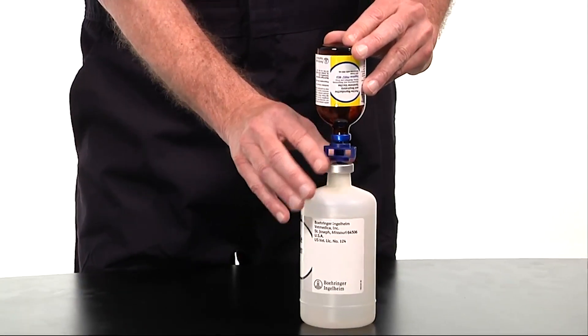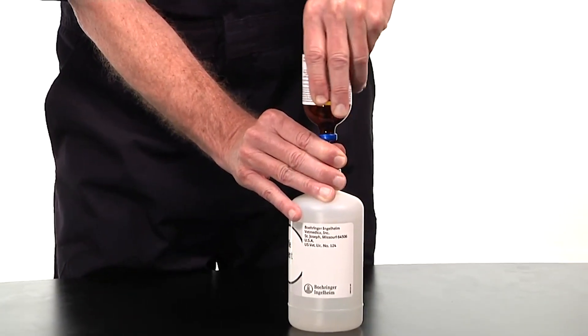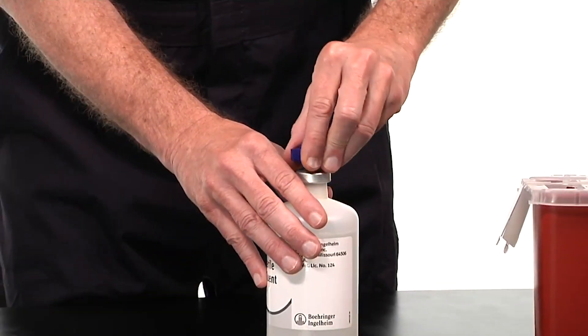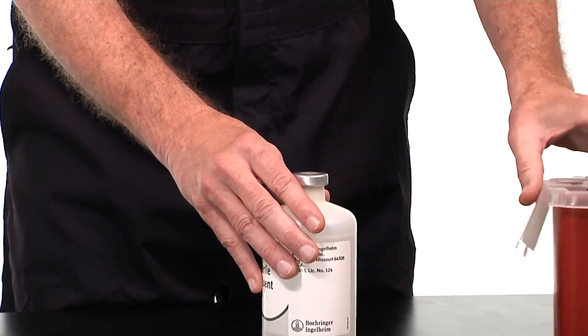When the transfer is complete, carefully remove the Ingelvac PERS bottle. Then carefully remove the transfer spike and dispose of it into an approved sharps container.